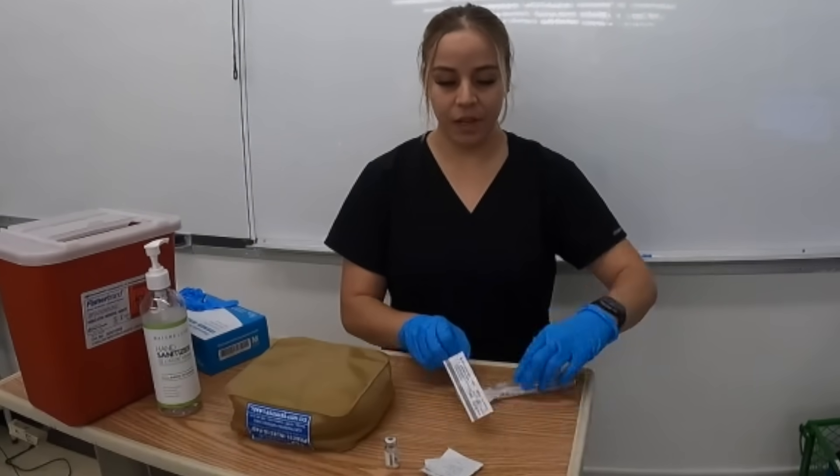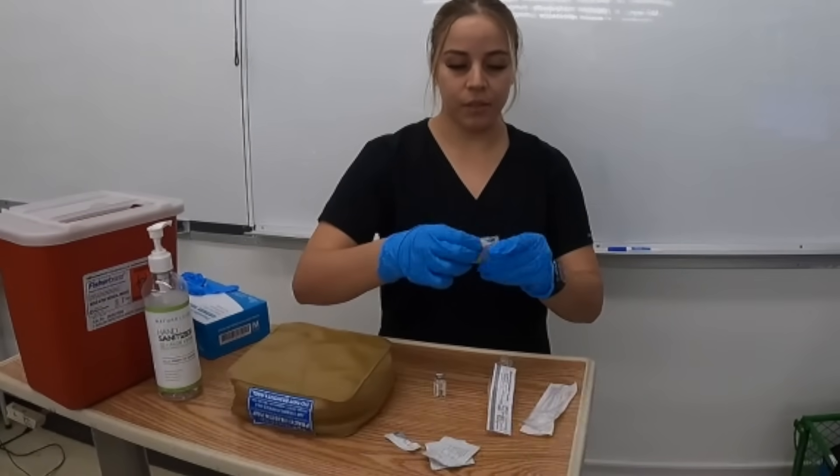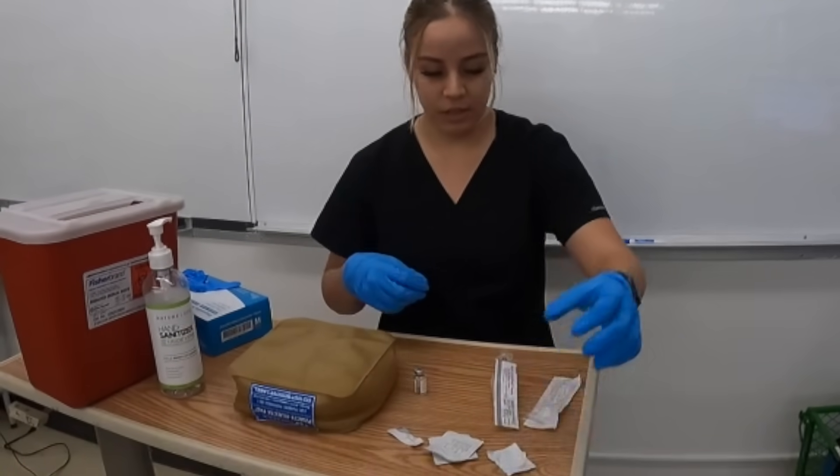Now that the syringe is prepped, I'm going to prep the vial and cleanse the top — one, two, three — depending on hospital policy for how you're supposed to clean the top.